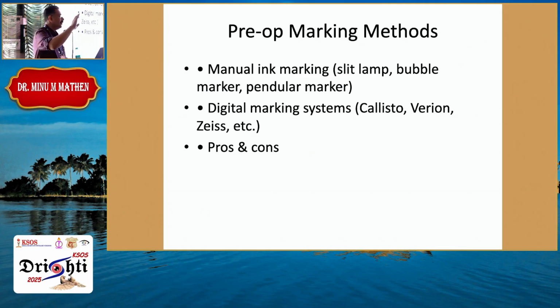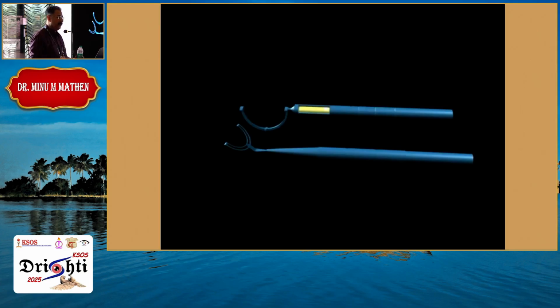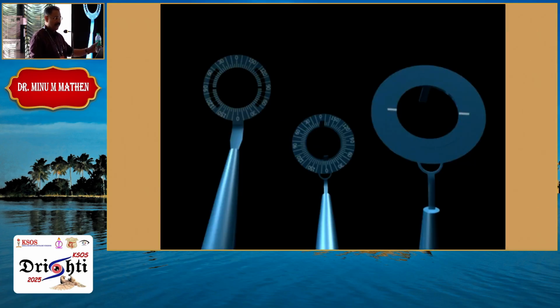So see, digital is beyond the scope of many practices. So there is no point in thinking that digital is the one. We have to depend on the marking, and the marking has to be done properly. All these other things, I have thrown away.